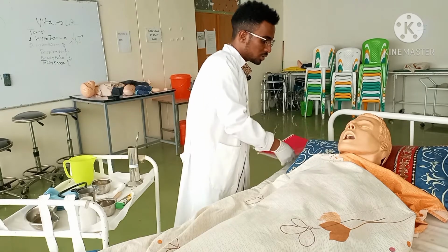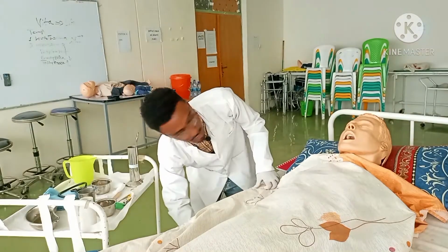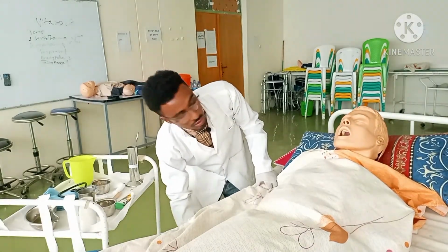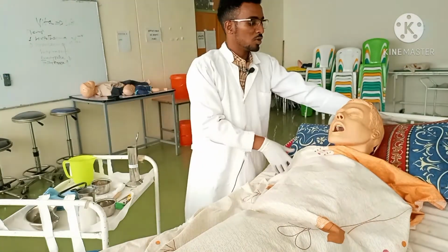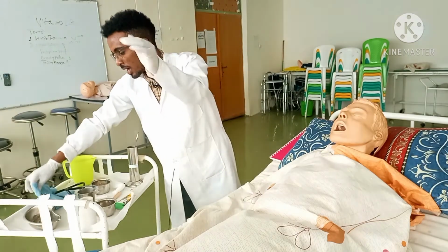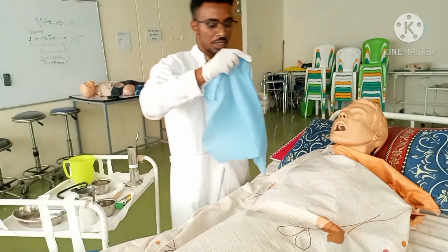So, he's Mr. John. Next, you have to position the patient. The appropriate position for nasogastric tube insertion is semi-Fowler or semi-sitting position. Okay, here is a semi-sitting position or semi-Fowler position. Next, you have to apply a drape sheet on the chest of your patient.